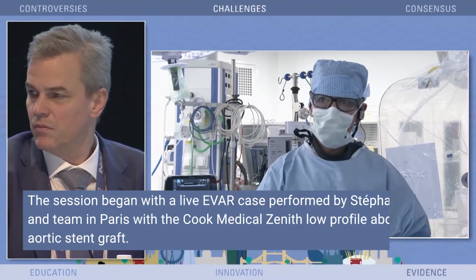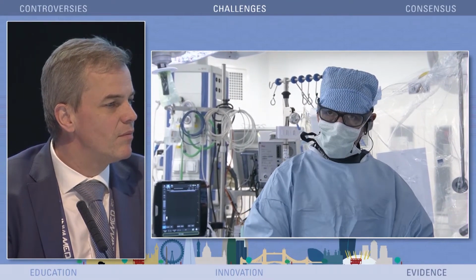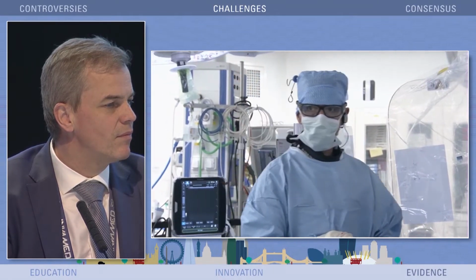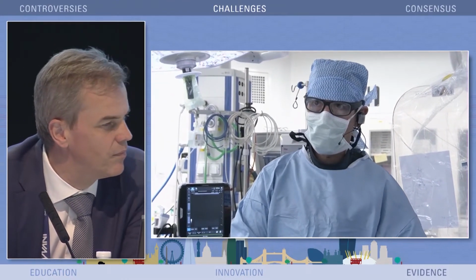So we're going to treat a 55mm AAA in a 64-year-old gentleman that is obese, has COPD, and a history of pulmonary embolism and high blood pressure. Next, please. So this was the pre-op workup.